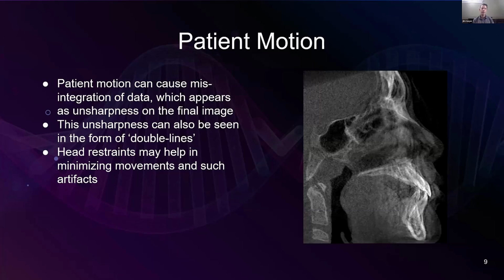Yeah, from the manufacturer side, and this goes for all manufacturers, we recognize that patient movement is an issue beyond telling someone to hold still in that device. So as you talked about, the temple supports, head restraints, but also a reduction in scan time, making that scan as fast as possible while preserving the image quality, is important. Having that quick scan time also assists in the minimization of the patient moving. I think that's what I wanted to add. Absolutely.